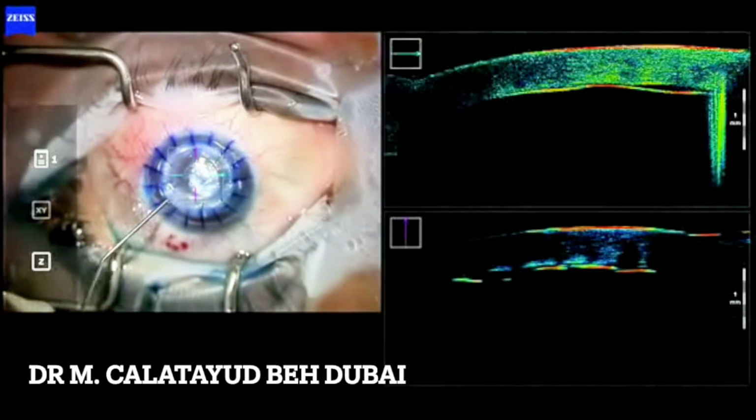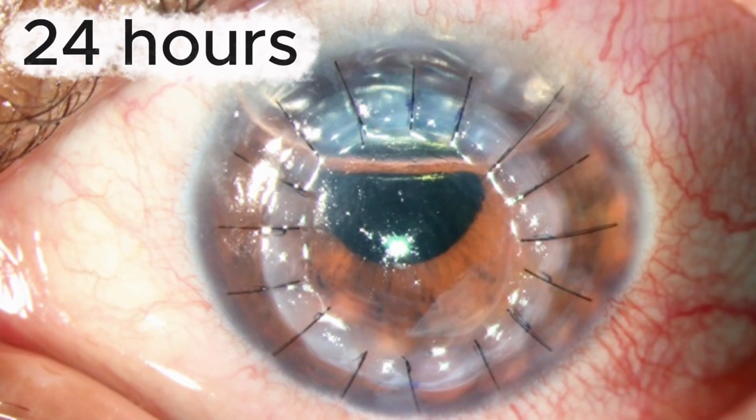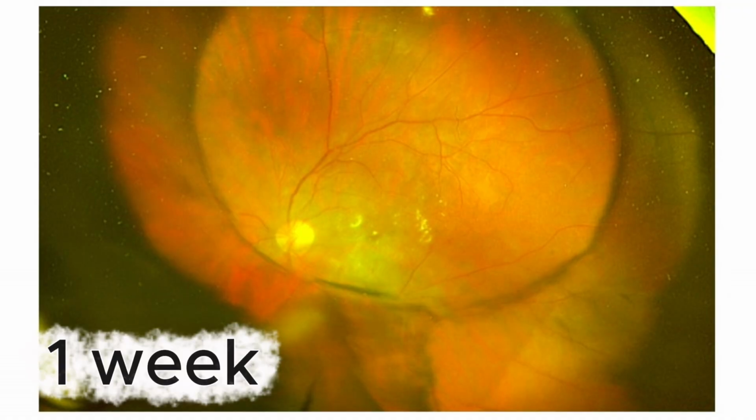We finish suturing the graft, and this is the image after 24 hours. Clear graft. One week later, we can evaluate retina with the slit lamp.